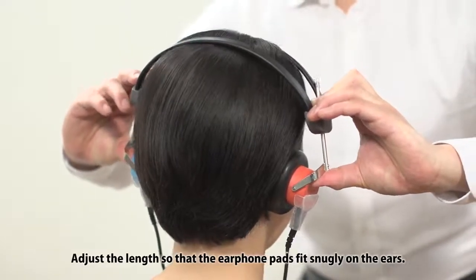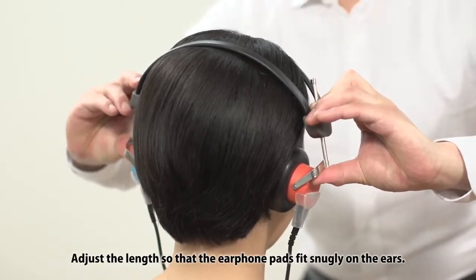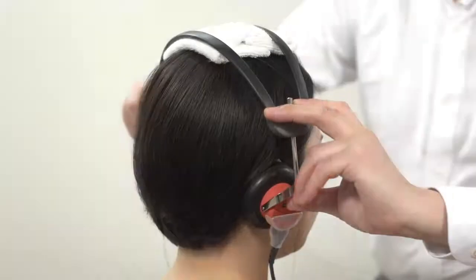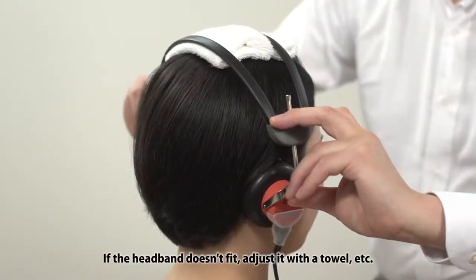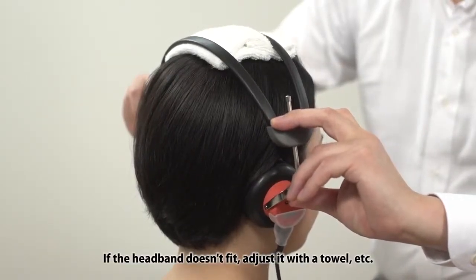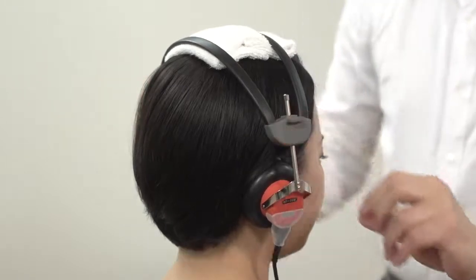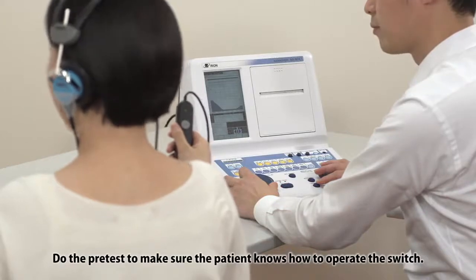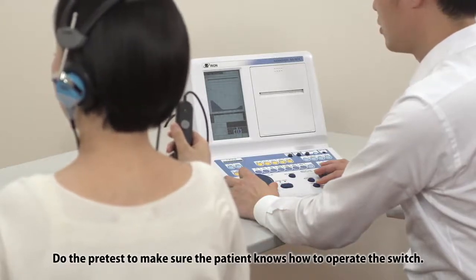Adjust the length so that the earphone pads fit snugly on the ears. If the headband doesn't fit, adjust it with a towel, etc. Do the pre-test to make sure the patient knows how to operate the switch.